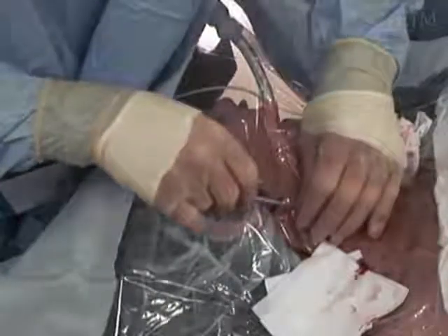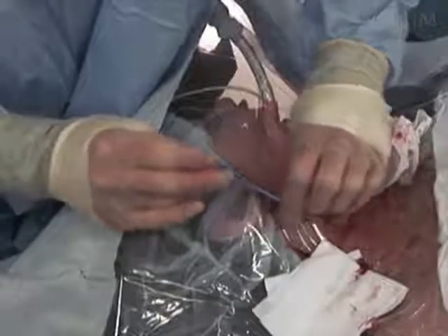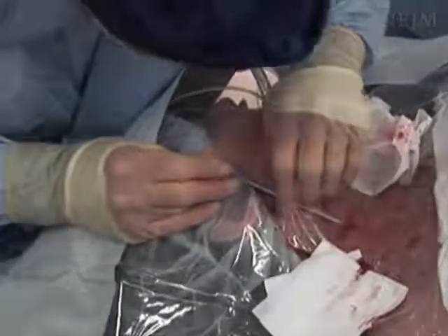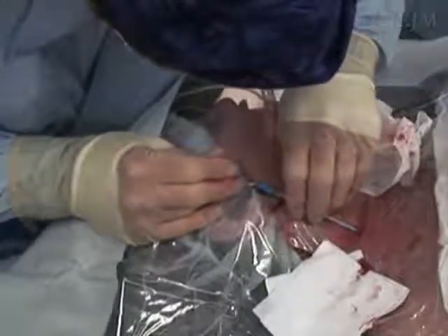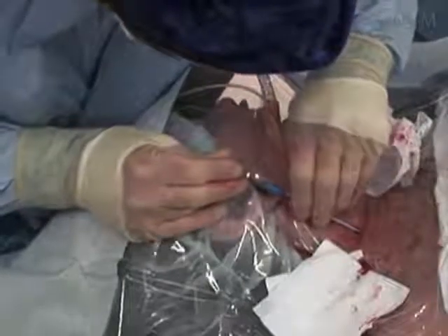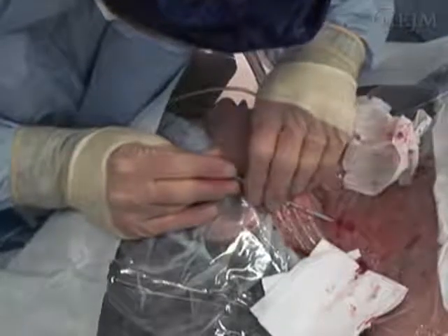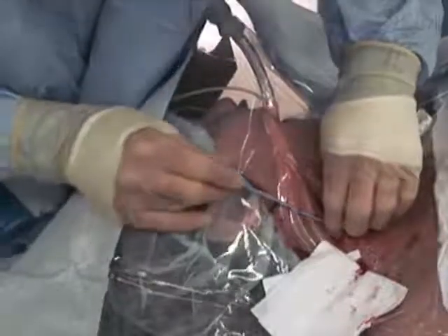Be careful not to cut the wire. Place the dilator over the guide wire, being certain to maintain control of the wire at all times in order to prevent a wire embolism, and advance the dilator 1 to 2 centimeters by holding it close to the tip and rotating it. Be careful not to introduce a bend or kink in the guide wire.